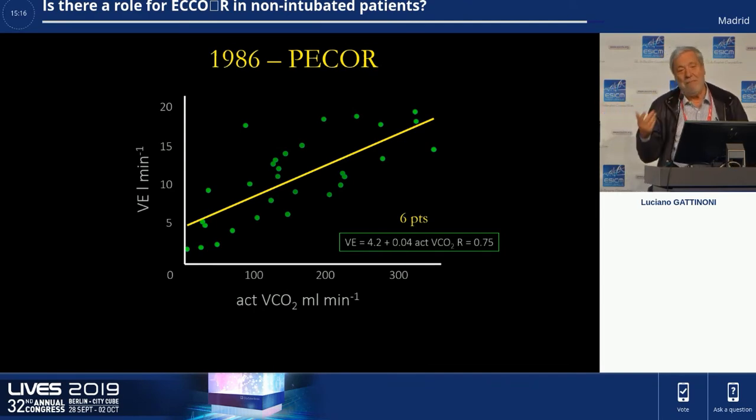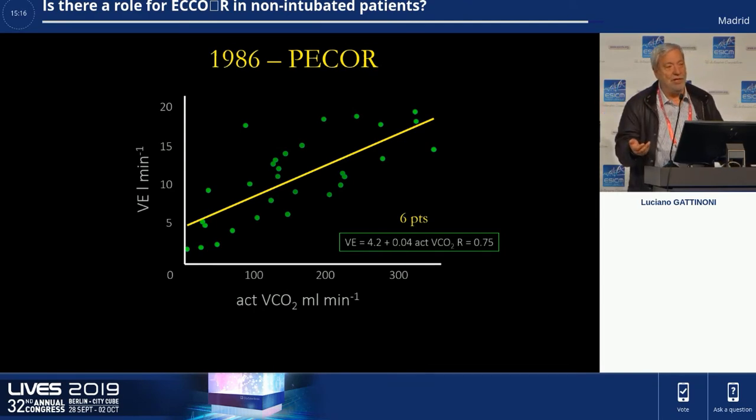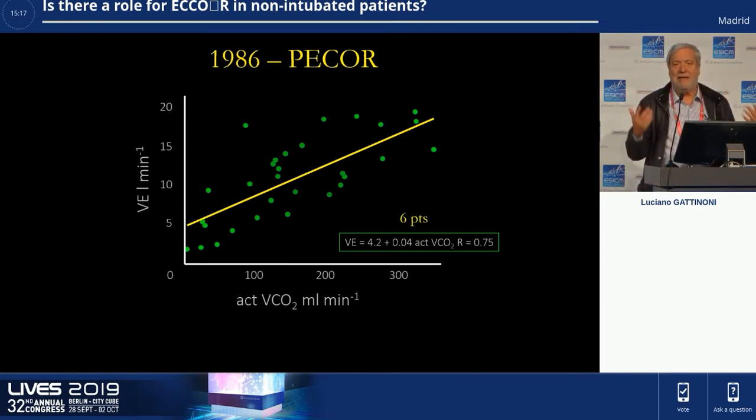But, a patient in very good conditions with some CO2 removal, or a patient, for example, with bronchopleural fistula. Sometimes you have this tremendous fistula you do not really know how to handle, because any time you ventilate, you maintain the leakage. With extracorporeal CO2 removal, you may invent a lot of situations in which the control of the ventilation is appropriate.